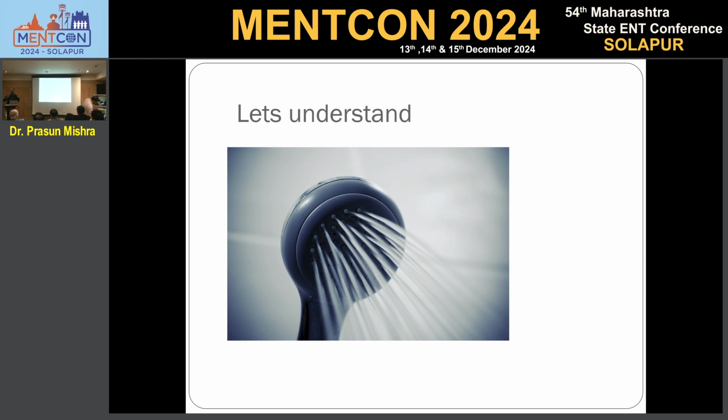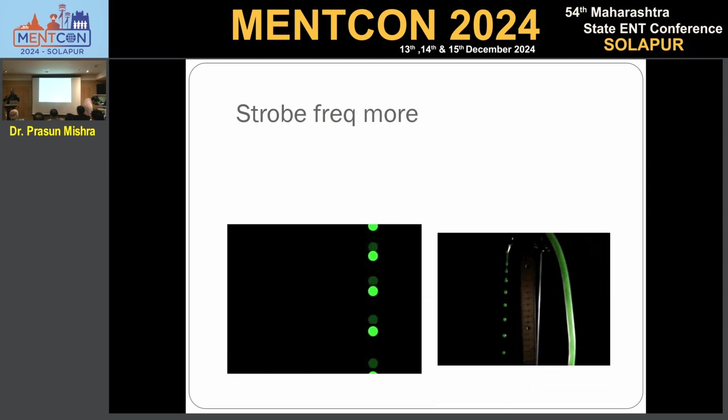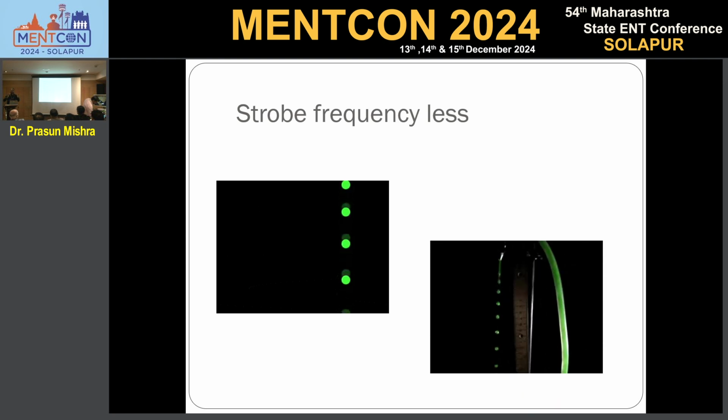I am sure most of you would have seen such cases where the patient has a bad voice. You put a VL scope inside, vocal cords appear normal. But unless you do a stroboscope, we will not find many pathologies inside. So these are all theoretical, a long lecture on this, but to understand this, if vocal cords are vibrating very fast, imagine it's a dark room where we have a ping pong ball, and I am throwing a ping pong ball from one center to the other. I would not be seeing anything.